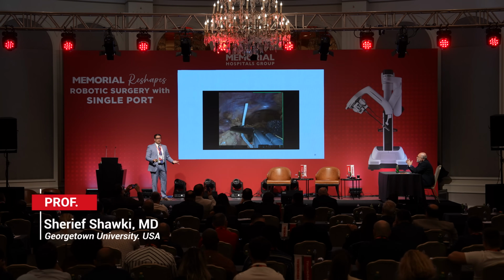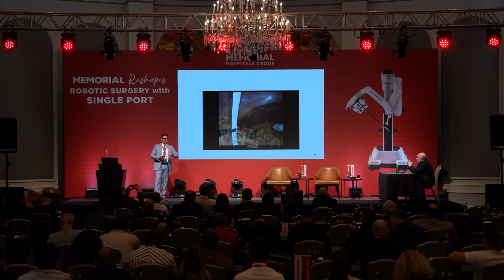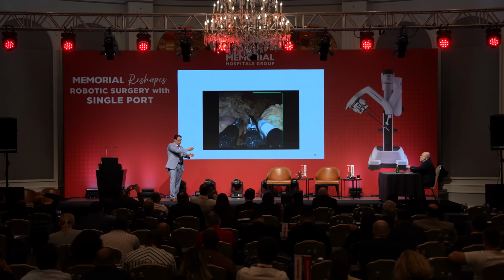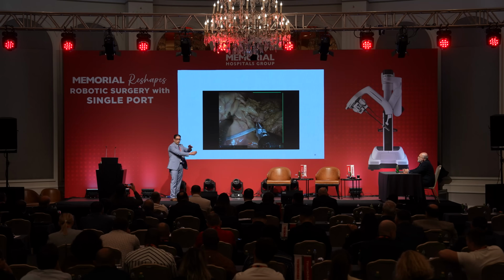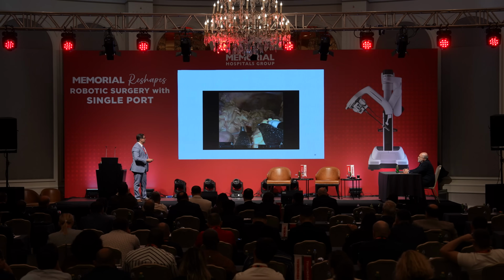So what does this mean? This means that when you are doing any surgery, you know that most likely you're going to retract, for example, with arm 3, which means your arm 2 can only work this way together. You cannot cross them. If you want to cross them, arm 2 pushes down, and arm 1 and 2 go together. They can work together. This is the implication of what I'm telling you here.